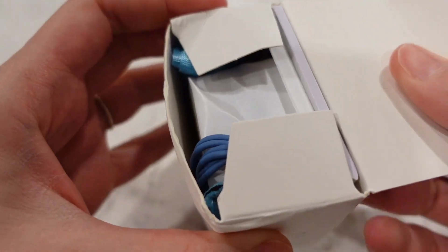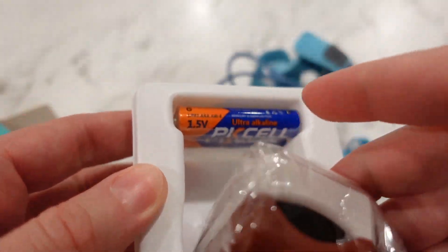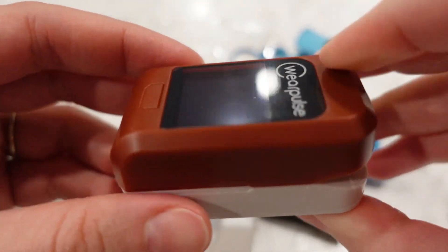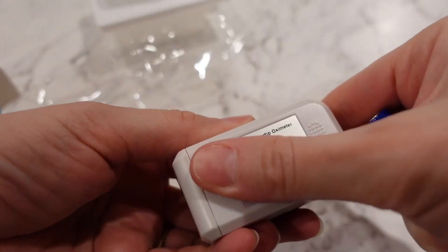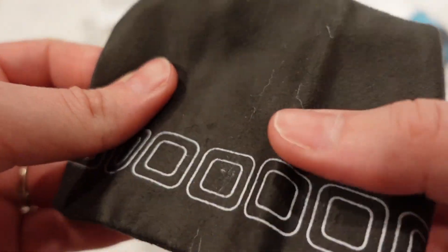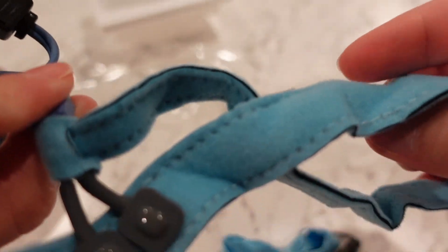Here is the unboxing. This oximeter comes with a one-year warranty, an easy instruction manual, the device itself, the batteries necessary — it uses two AAA batteries — a carry pouch, and the baby sensor attachment which goes on your baby's foot.